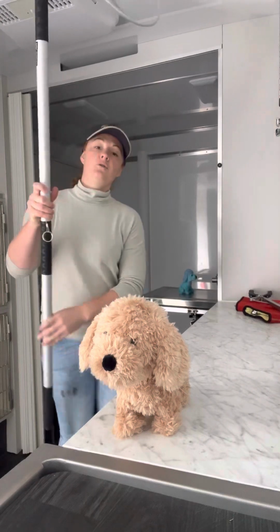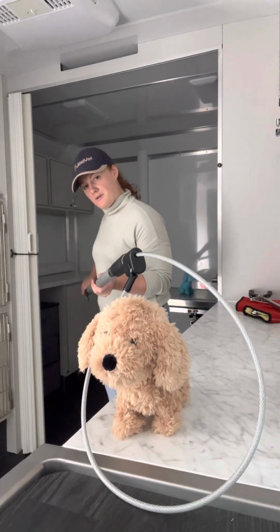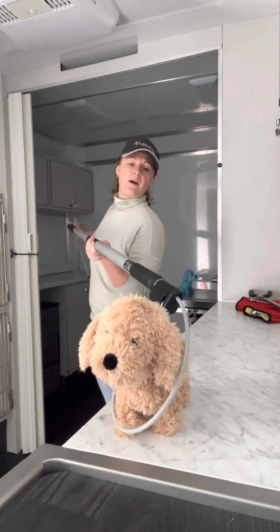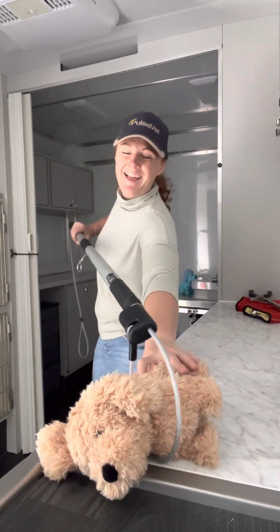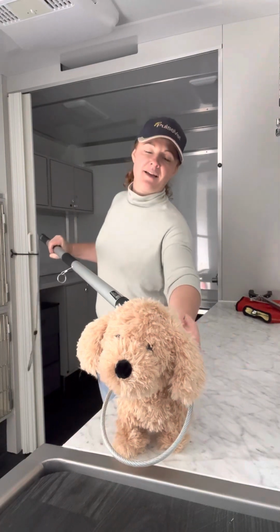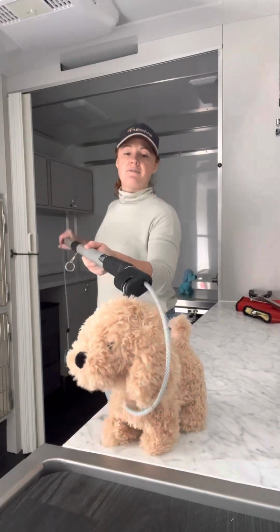So you pop this across the animal's neck like that, and then you pull from the back. I'm going to pull this little wire here, and basically it slowly gets smaller, and that way you can hold the animal. They can move around, but you've got them nice and safely. No one's going to get hurt. They're not going to be able to bite you. You're not getting into their space, and then you can inject them from the back, or even a team member, if you need two people, can inject them from the back whilst everyone is safe and sound.